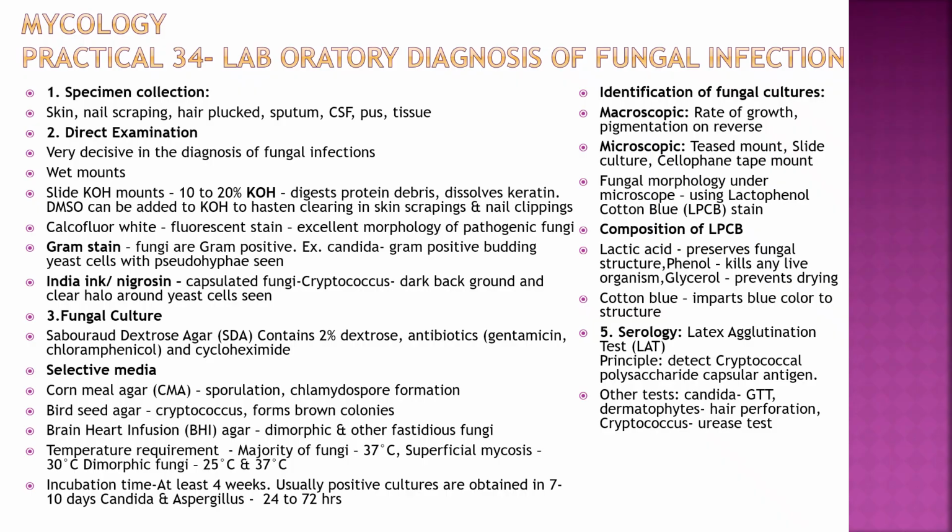Mycology, the study of fungi. Lab diagnosis of fungal infection. First, specimen collection: skin, nail scraping, hair, blood, sputum, CSF, pus, tissue. Direct examination, mainly a 10% KOH wet mount. KOH will digest the debris and keratin, and then we can see the hyaline structure of the fungal cells. Then Gram staining, and India ink for capsule demonstration.